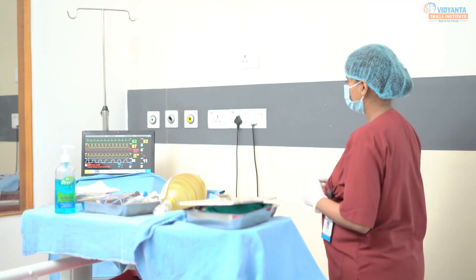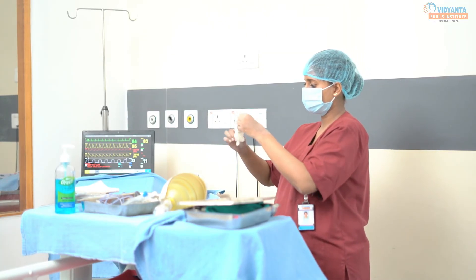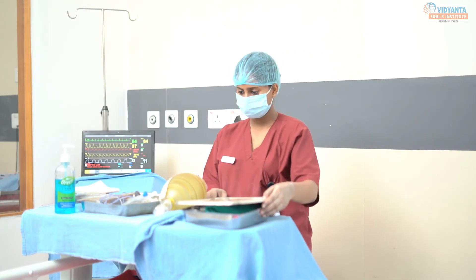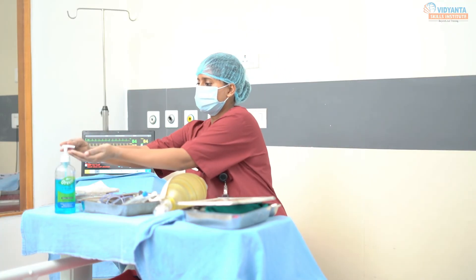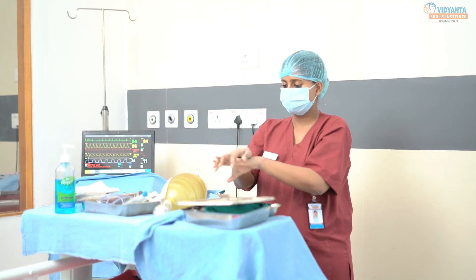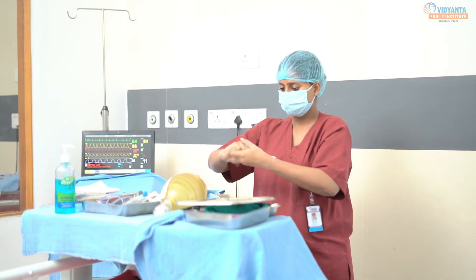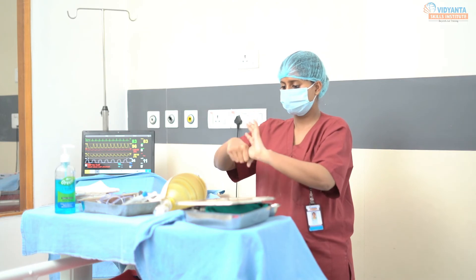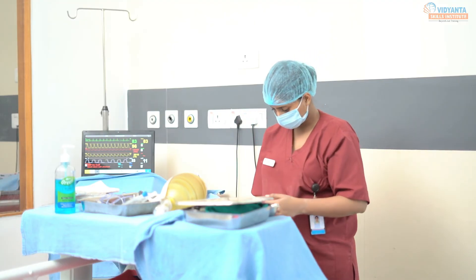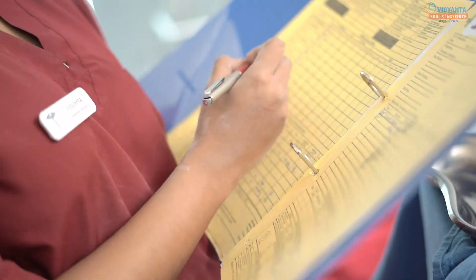After care: monitor the post-procedural vital signs. Discard the waste according to BMW policy and replace the articles. Perform hand hygiene. Document the procedure in the nurse's notes including stoma color and the client's breathing status before and after the procedure.